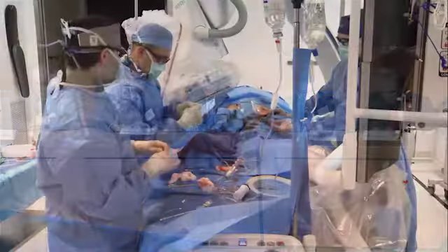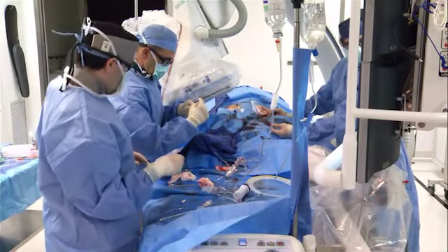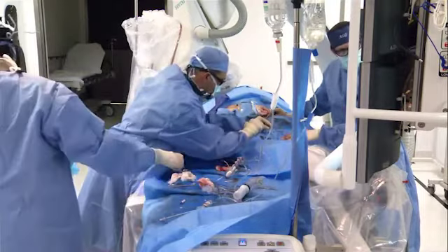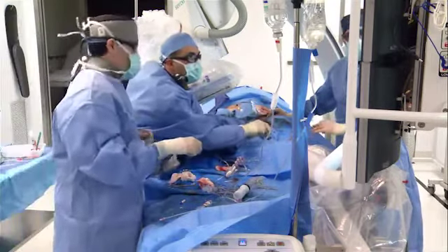Yeah, and you will need an .018 guide wire anyhow if you want to implant a Supera, so downsizing of the guide wire makes sense. Yes. Okay, I just hope this wire goes. We may have a channel there actually. Yeah, maybe you want to put this as a roadmap. Oh, it is there? Okay.